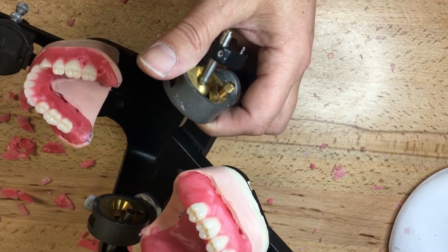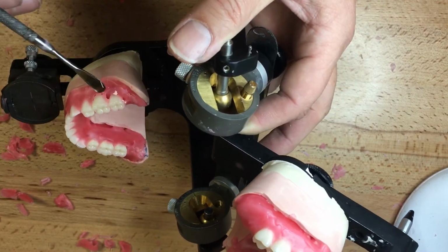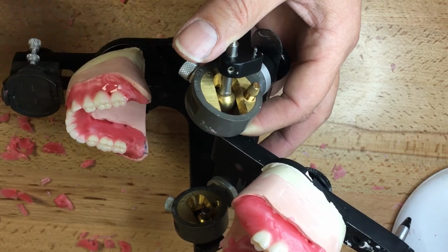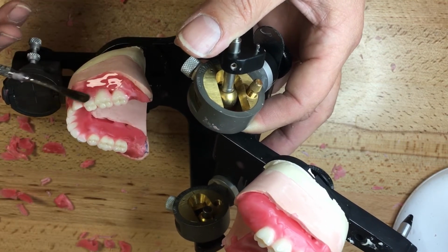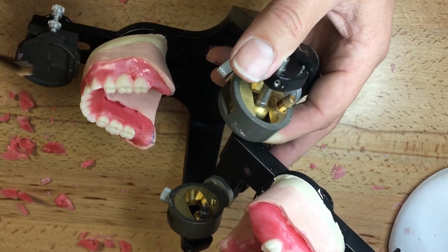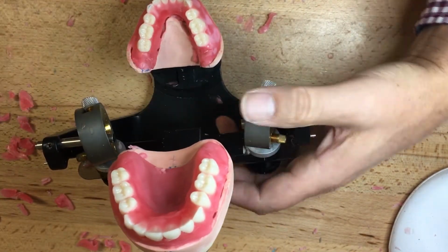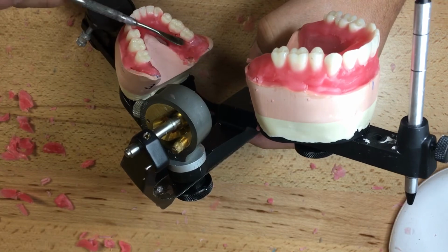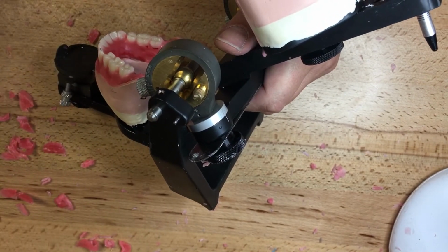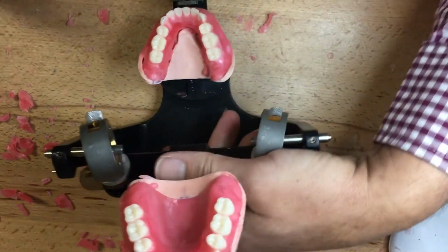Now, I know many people out there saying, well, you're doing things twice. When you have some experience, you can do it all at once. If you're using average values of 30 degrees, it's not going to change from day to day. It'll be the same the next day. If you're doing protrusive bite records with condylar guidances of 10, 20, 30, 40, then you can adjust accordingly, providing you have experience with the denture teeth that you're using. But this is the novice or beginner to novice. So I think if we can get things on a flat plane, let's start there. And if we can get that, then it'll be very easy to move forward.